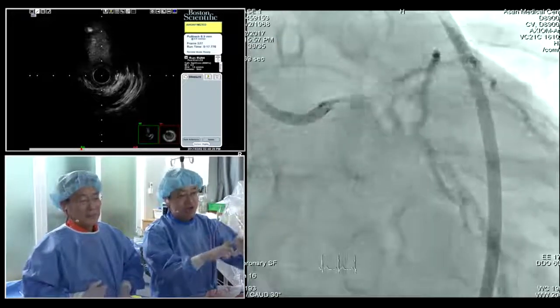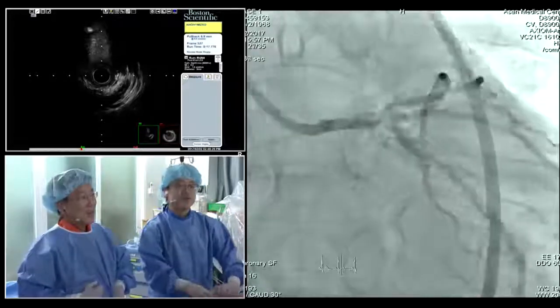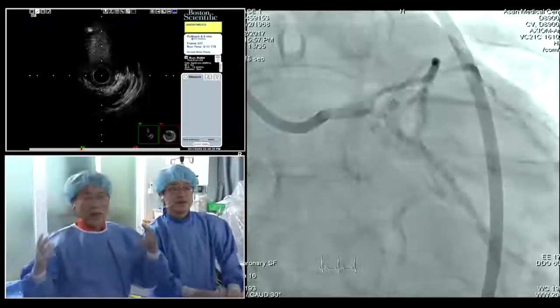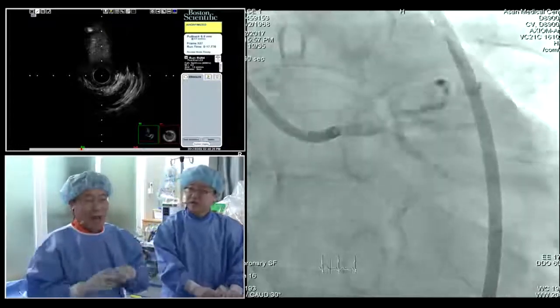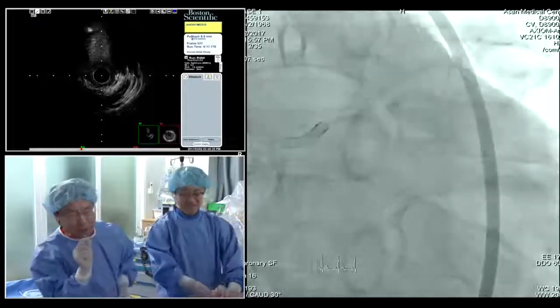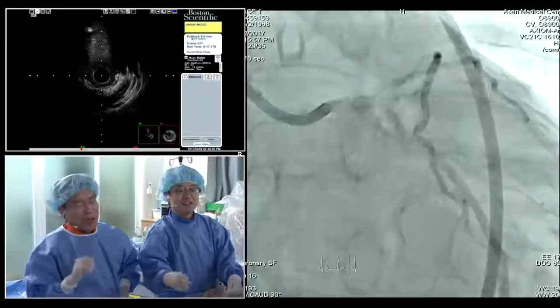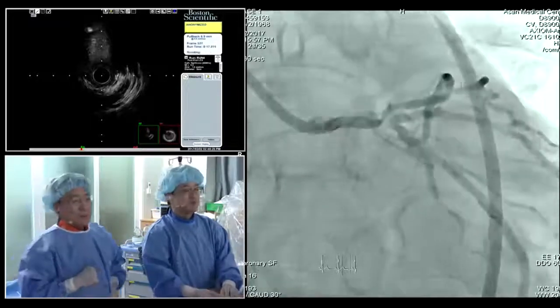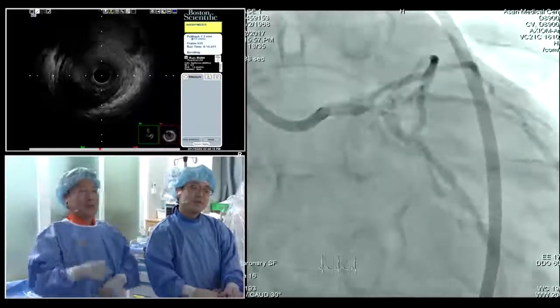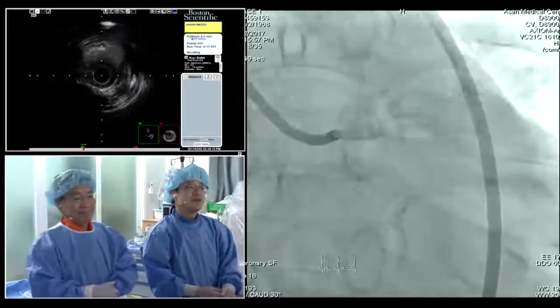The RI ostium looks okay. The plaque was just confined to the circumflex ostium. To be honest, we have spent a lot of time doing IVUS and the procedure, and by angiographic findings we are sure the ramus branch would be okay. So what about the treatment concern, Dr. Lee? Would you discuss that? Dr. Matthew, what about your opinion?